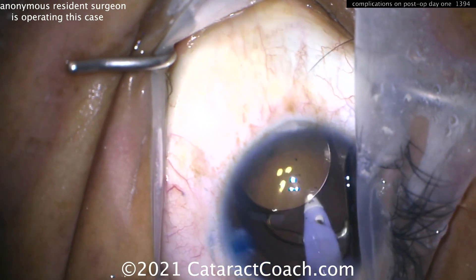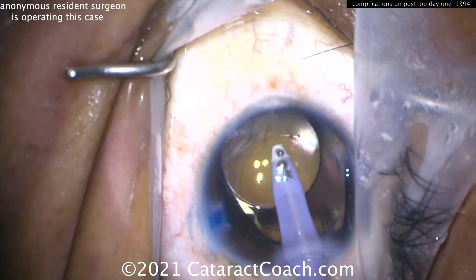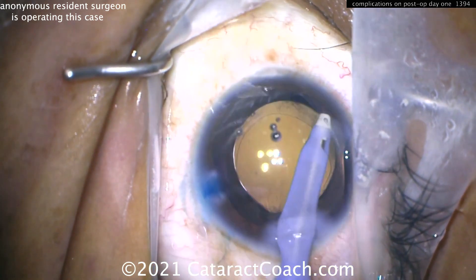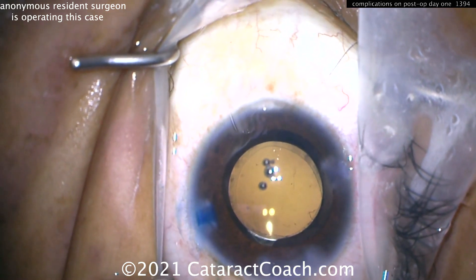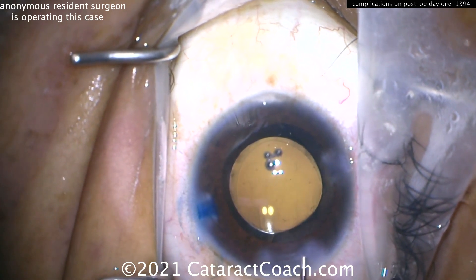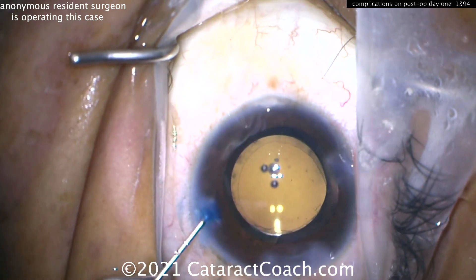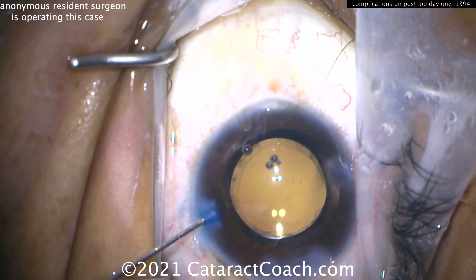At the end of the case, the resident is removing viscoelastic and going behind the lens — good job. But I can already tell you that trailing haptic under the incision is not in the capsular bag; it's come out into the sulcus, and the resident doesn't realize it. A couple of clues: look and ask where's the rhexis — do you see the full 360 overlap of the optic? No. Look to the right at the incision: the rhexis is under the IOL.